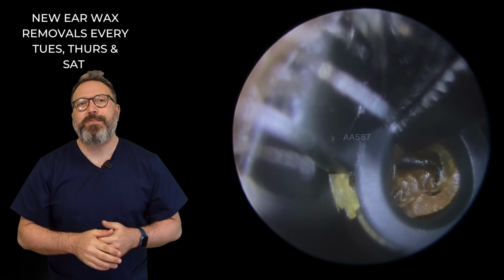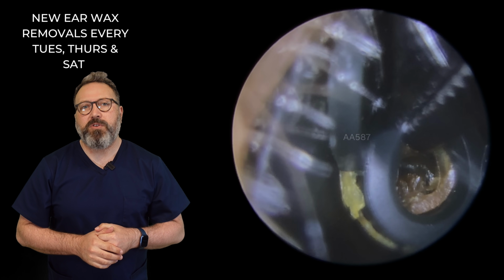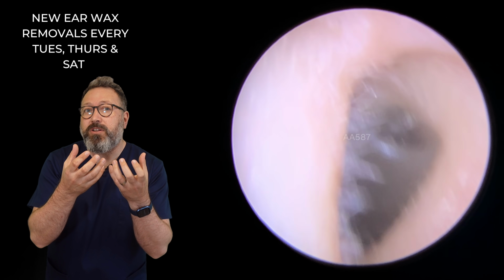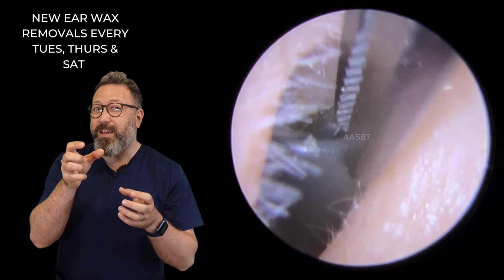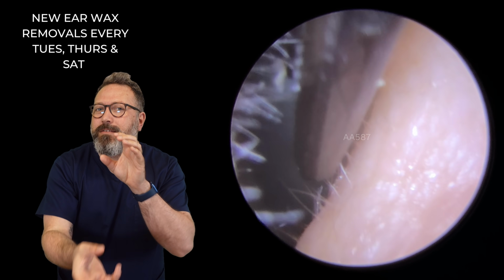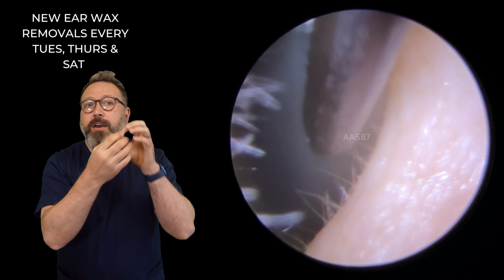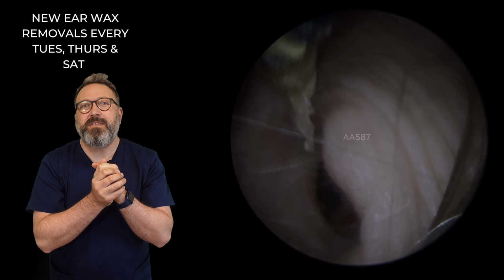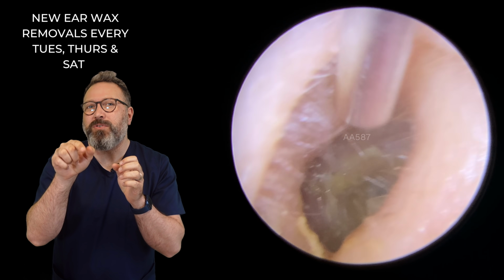So we're just going to take this away. You can see we're holding onto this with a crocodile forceps. We're going to slowly bring this down. But you can see it's just got a little bit stuck at the entrance. It's a pretty big piece inside of this, but look what comes out attached to the end of it. It's not an eardrum or anything, I promise, okay? But you look at the end of this, you'll see that white material under there. Now, we will show you that in a bit more detail.